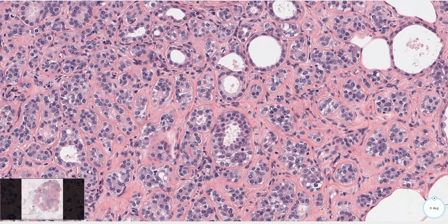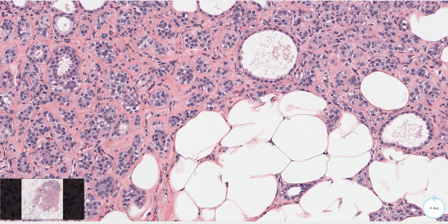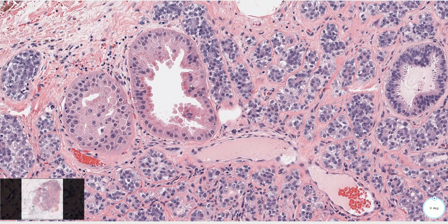The myoepithelial cells are typically localized in the periphery of the cellular nest, but sometimes they can be intermingled between the epithelial cells. Here we have entrapped adipocytes, and apocrine metaplasia is also quite commonly seen in these tumors, as we can see here.